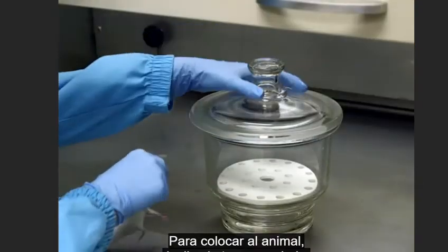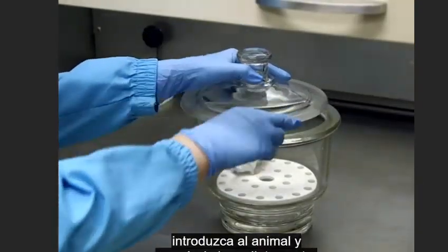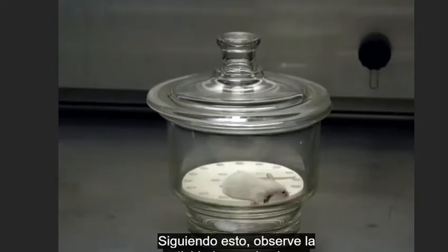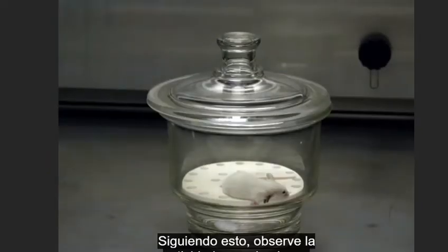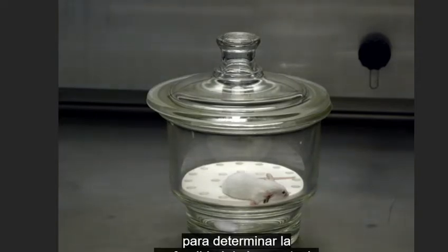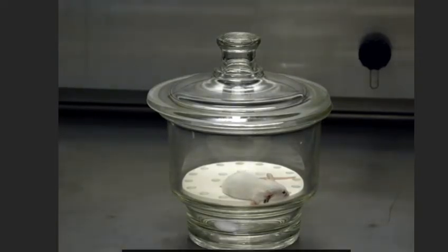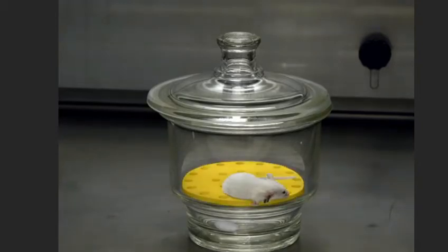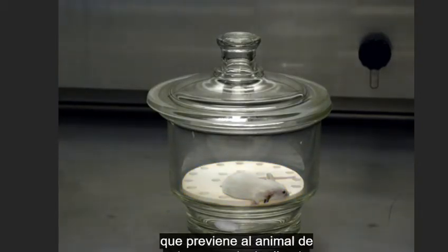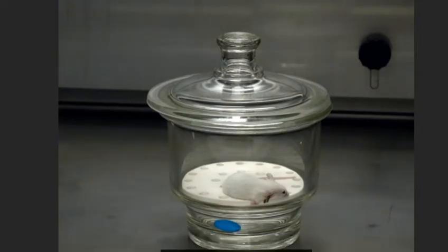To place the animal, slide the lid to one side, introduce the animal, and secure it immediately. Observe the activity and respirations to determine the depth of anesthesia and expose the animal to the inhalant to effect. Note that the platform serves as a barrier and prevents the animal from coming into direct contact with the liquid anesthetic.